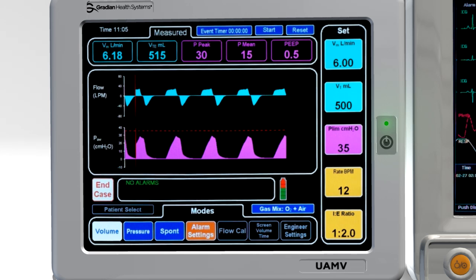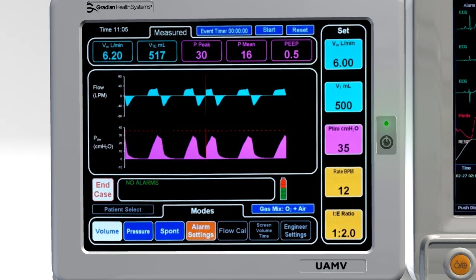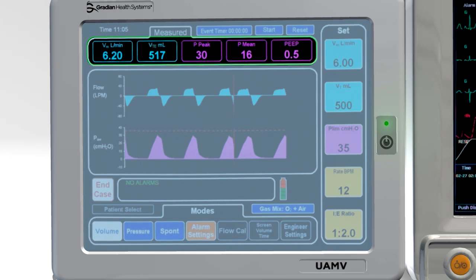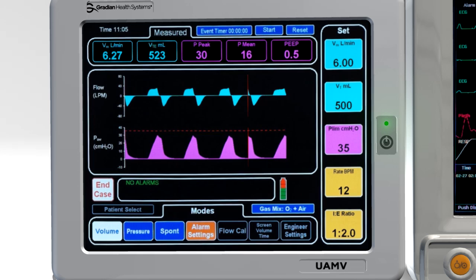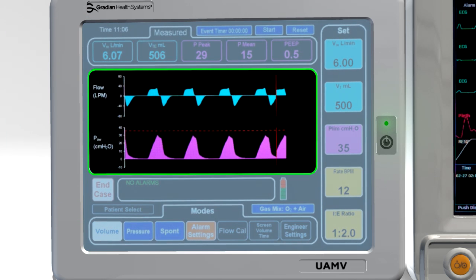Delivery settings are grouped together. Volume, pressure, rate and IE ratio are individually adjustable. Output measurements appear at the top and show volume, pressure and PEEP values. Several graph options are available to plot flow and pressure versus time as well as compliance loops.